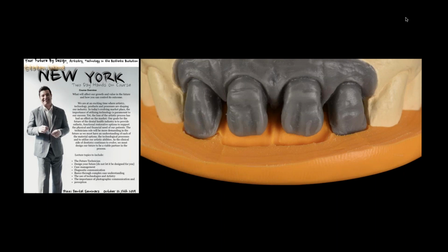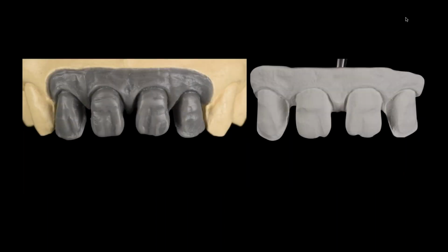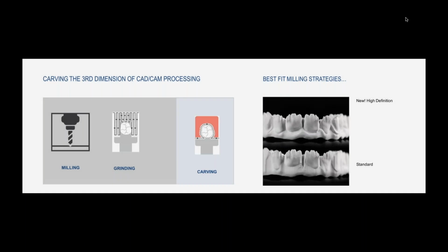But in the end, this is what we're going to try to address, right? The goal here is always to talk about how we manage space and color. And the other part of that is, now that we understand what our frame should look like, how do we mill it that way? Because I'm going to tell you that 2 years ago, I probably couldn't have. My milling machine would maybe double scan and copy what I put in there, but it would never really reproduce exactly what I have.